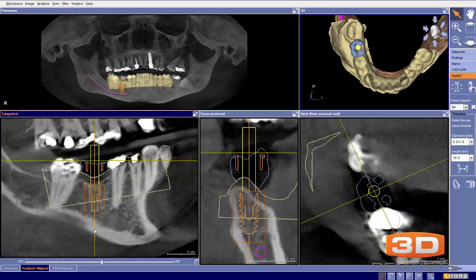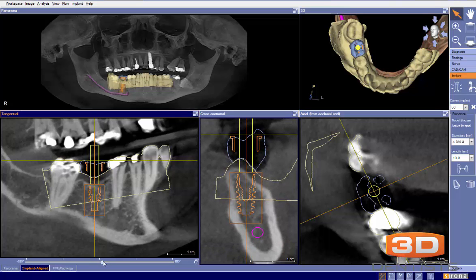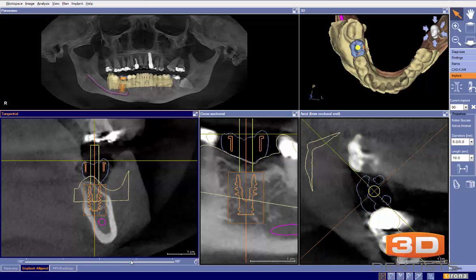Now that will create our occlusal plane to be off, but what it will allow, which in this minor amount would be more important, is having a better emergence and hygiene profile here. That's that. Now, in terms of the nerve, I think the nerve is a non-issue here. Also, I would go to a 5 millimeter wide implant. I think the nerve is a non-issue in this particular case.